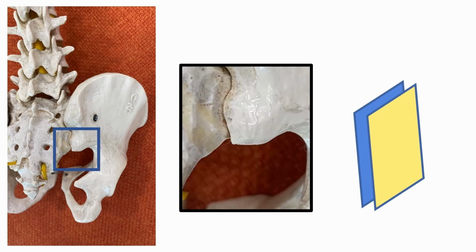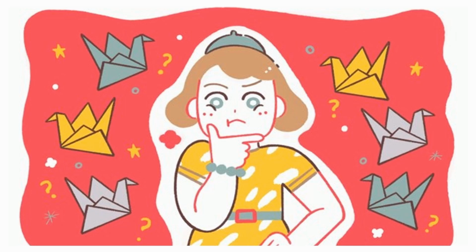In the diagram, the iliac bone is represented by a yellow plate, and the sacral bone is represented by a blue plate. The alignment of the joint line can be in inferior lateral oblique, vertical, or inferior medial oblique directions. The procedure is simplified if the iliac side is shorter than the sacral side, as it allows for a wider opening of the inferior joint space. However, when the iliac side is longer than the sacral side, it can pose a challenge. Any bone spur on the sacral or iliac side can block the gateway. Thus, observing the bony anatomy before introducing the needle is recommended.